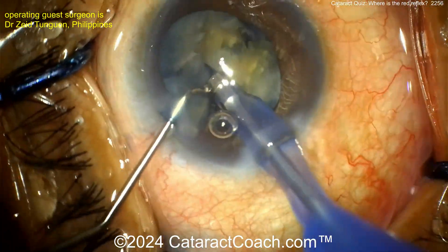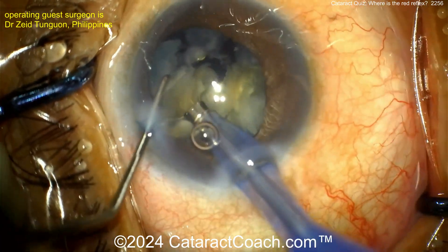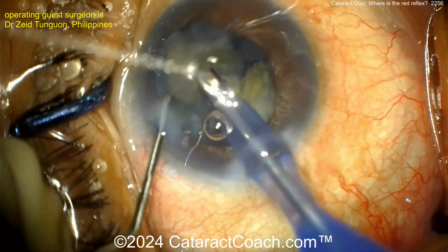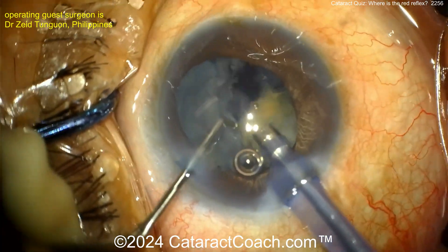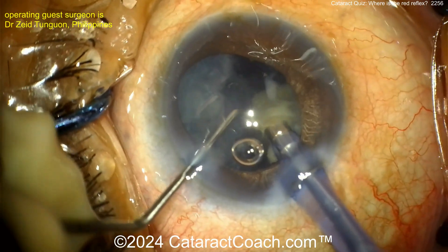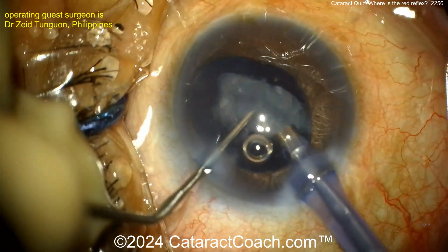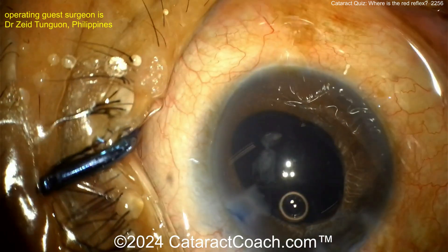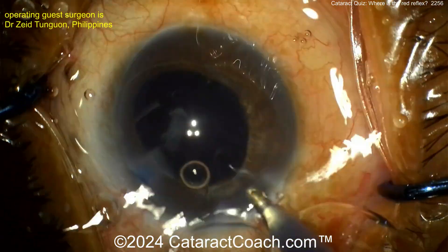Get your cataract pieces up out of the bag — stay away from the bag because the posterior capsule is hard to see. Get those pieces up to the iris plane and just emulsify them, taking your time. There we go — another one goes down pretty easily. That looks pretty good.